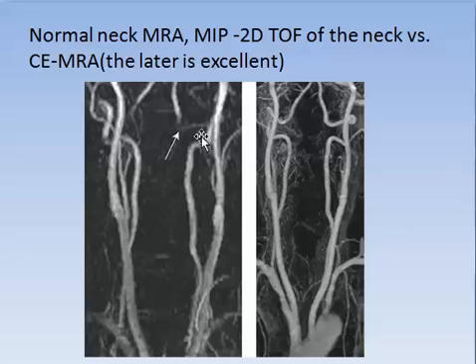So the better is the contrast enhanced MRA. Time of flight 2D and contrast enhanced. The best is contrast enhanced. These are the two used in the neck, the 2D time of flight and the contrast enhanced MRA. Contrast enhanced MRA is better than the 2D time of flight.